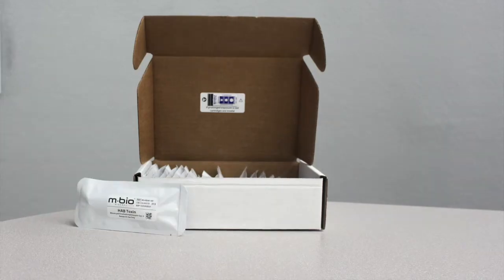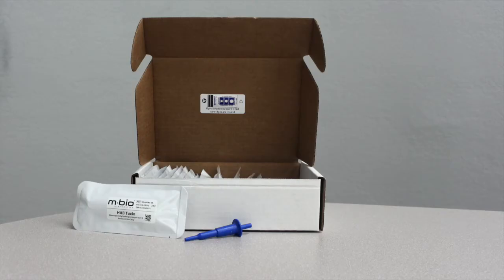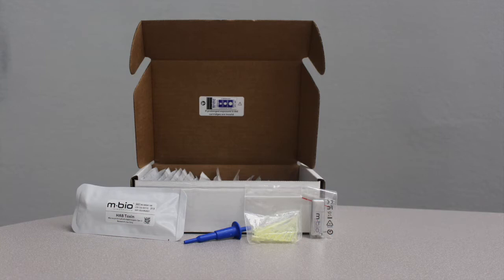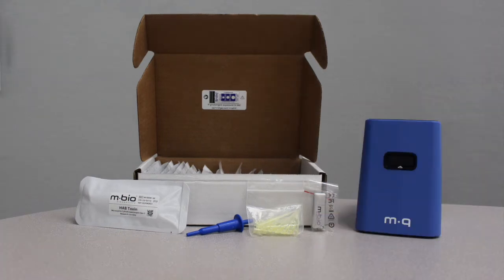20 cartridge bags, which contain both the cartridge and reagent tubes, provided with the cartridge kit. A 100 microliter fixed pipetter provided with the MQ instrument, a bag of disposable pipette tips provided in the cartridge kit, one USB stick provided in the cartridge kit. You will also need the MBio MQ machine along with a waste container.